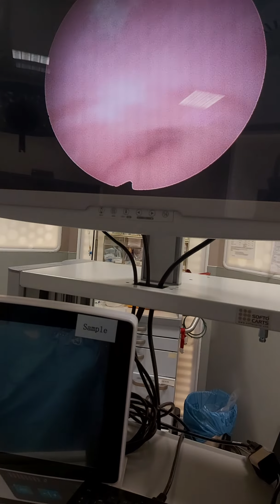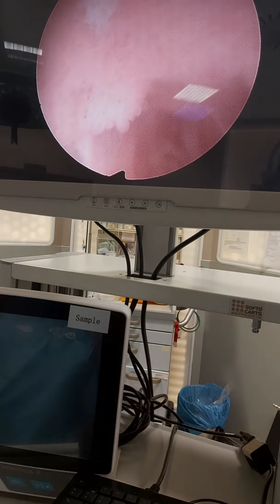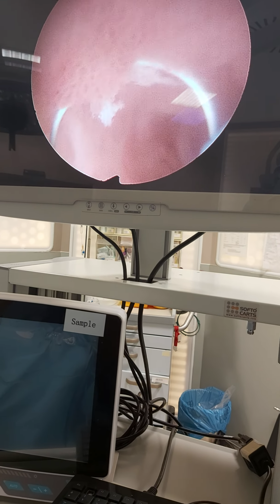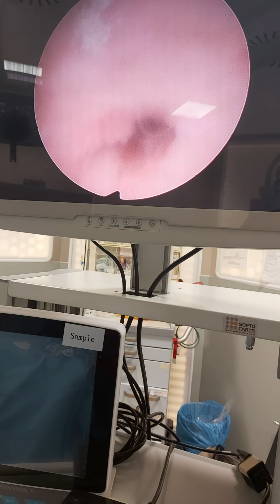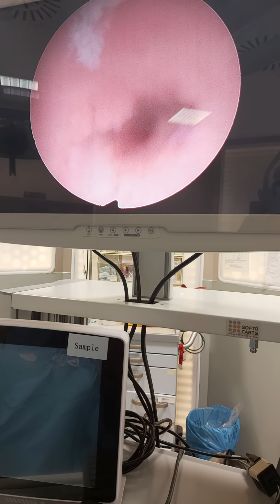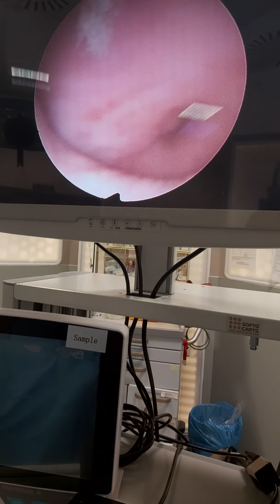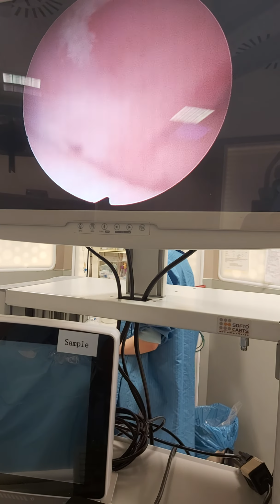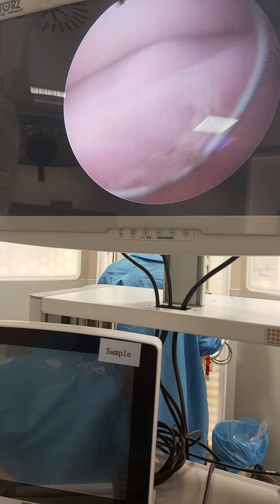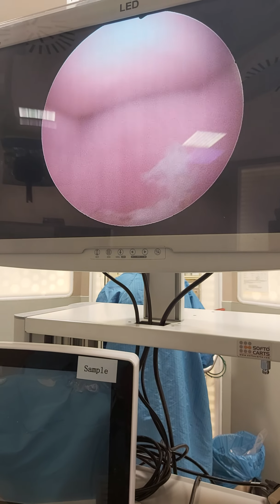Here, I don't treat these tissues simultaneously with my operation because it gives a lot of difficulty in the healing period. Maybe in the future I can resect these tissues too, but this is the duty of gynecological colleagues, and I will send this video for their consultation. Really, it's not a big issue. It can be done under local anesthesia in the office. It doesn't need general anesthesia or something like this, so it has to be done later. I don't want a simultaneous procedure.